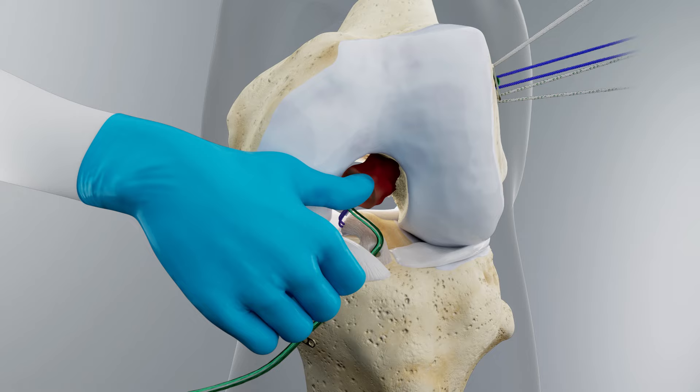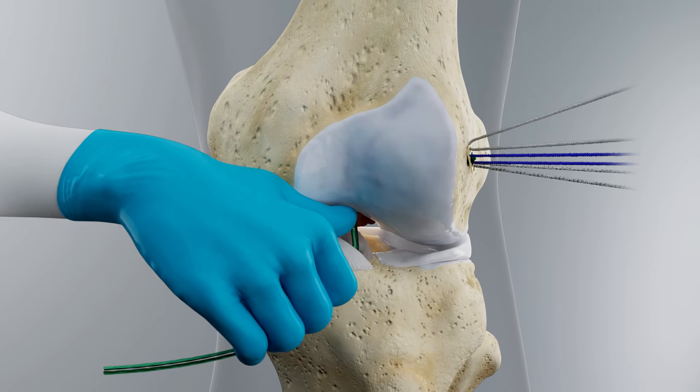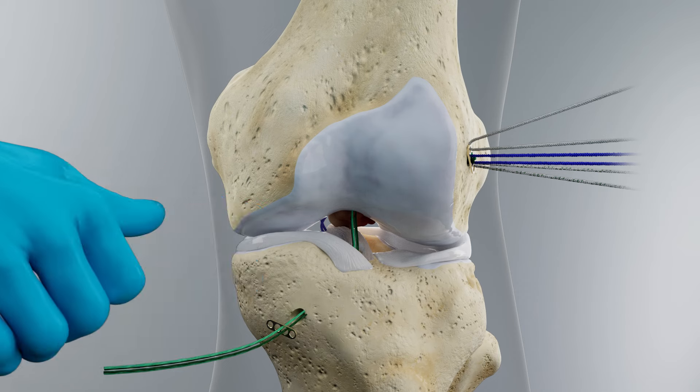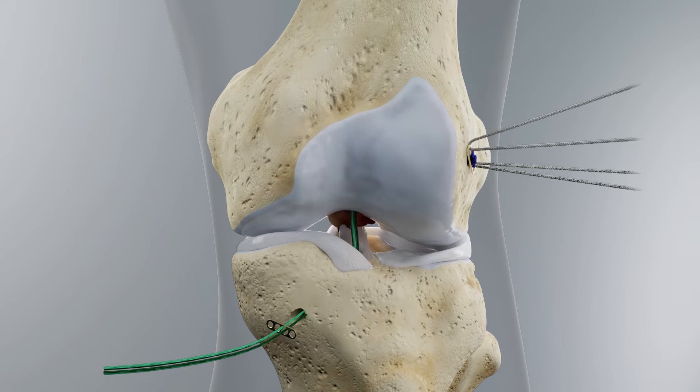Pull tension on the cinch sutures exiting the distal end of the implant and slide the implant along the taut sutures into the notch. If needed, add a small amount of remaining blood to the distal end of the implant so that it is fully saturated. While holding the bare implant in the notch with a thumb, pull the cinch sutures exiting the tibial tunnel and bring the knee into full extension. Place the leg on the table to keep the knee in full extension. Pull the stump sutures exiting the lateral femoral tunnel, dunking the tibial stump into the notch and blood-soaked bare implant.